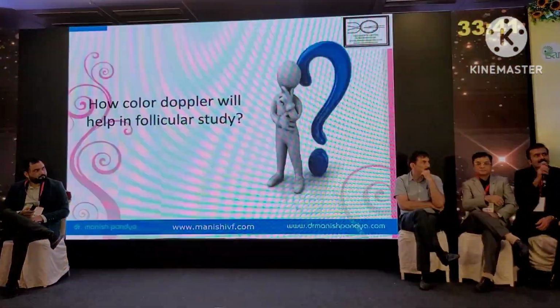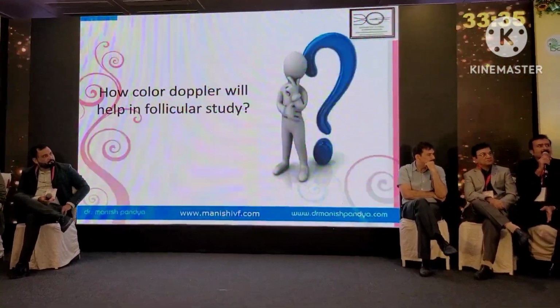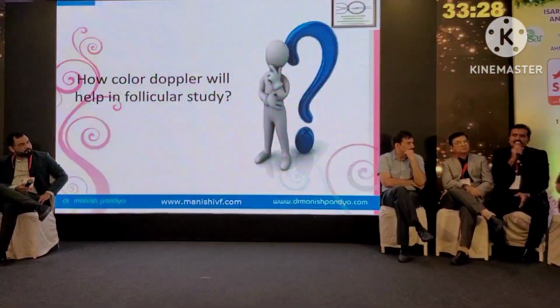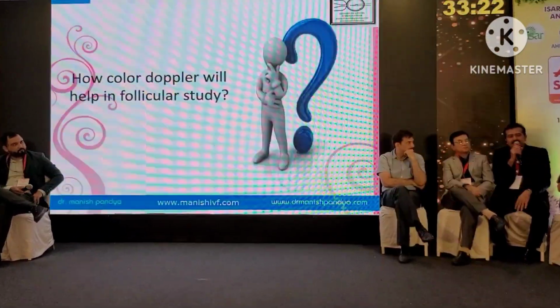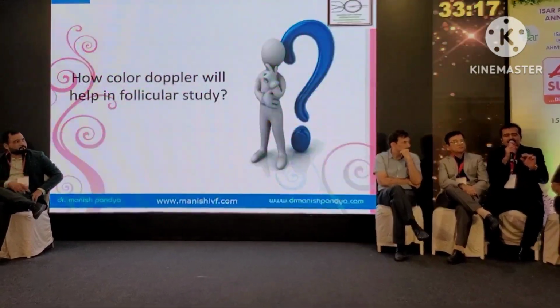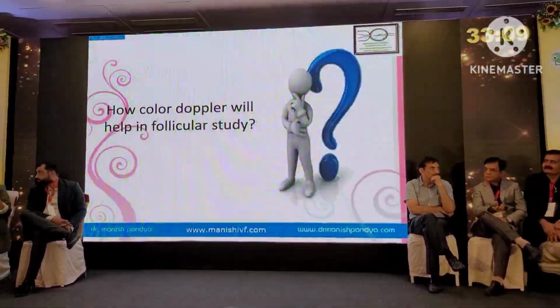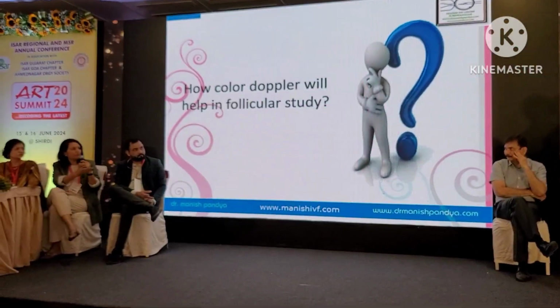Sir, one question. In FET cycles, when we give exogenous estradiol and we see the endometrium on day 10, it is 9.5 or 10 mm. When we see it after 4 or 5 days, the thickness of the endometrium reduces a bit, from 10 mm to 9 mm or 8.5 mm. Is it a good sign or a bad sign? It's called endometrial compaction. It is a good sign. When there is more than 10%, it gives the best result in IVF.